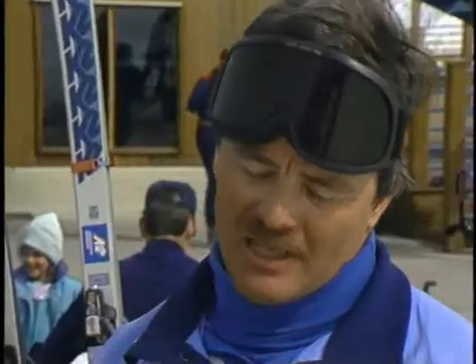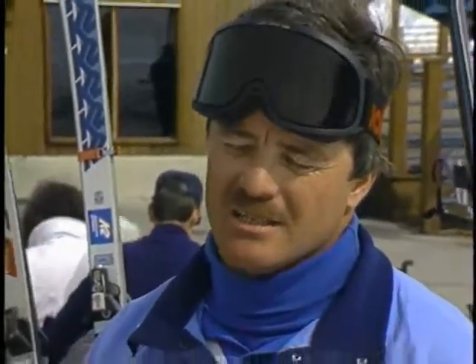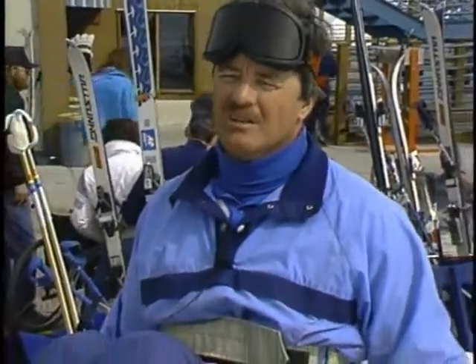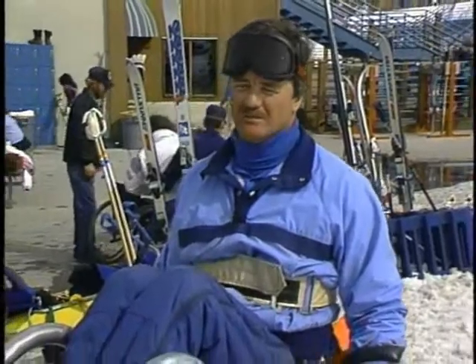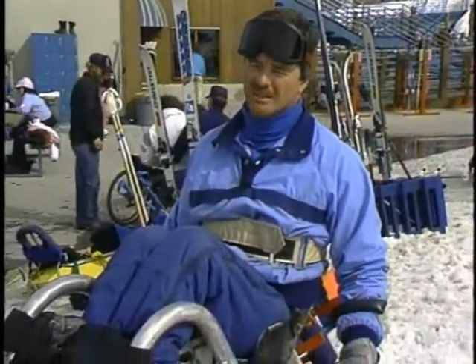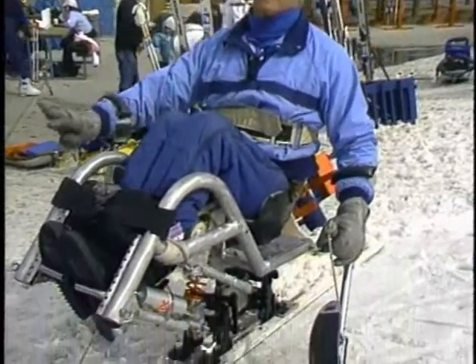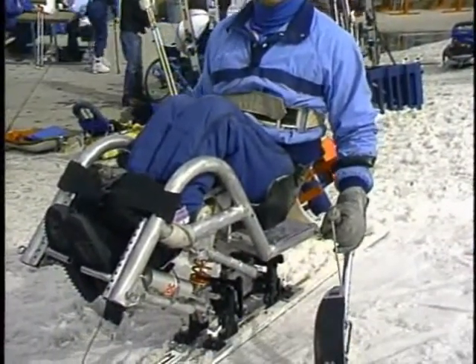on the snow. So it'd be faster and more controllable at the same time. Now the latest development on the bi-ski is that now I'm able to put more angle on my downhill ski, very similar to what a stand-up does with their knee on the downhill leg and ski. So that you tilt your knee in to put more angle on the downhill ski. Now I can do that on this device.